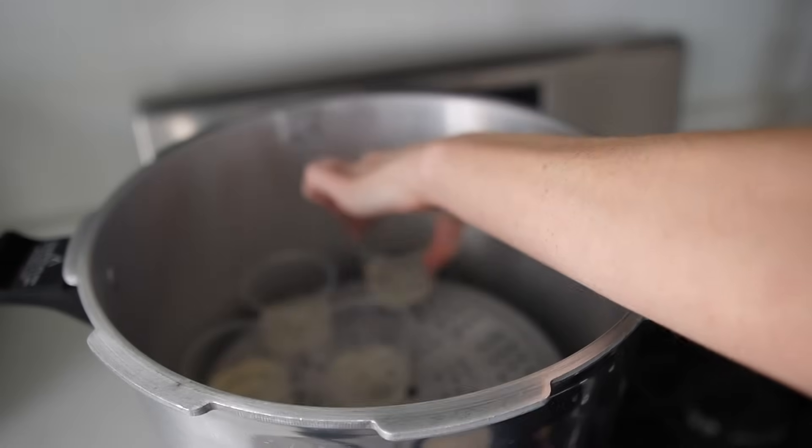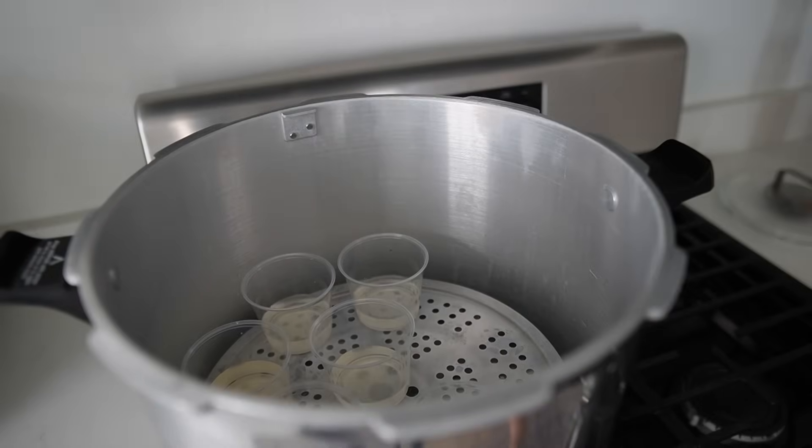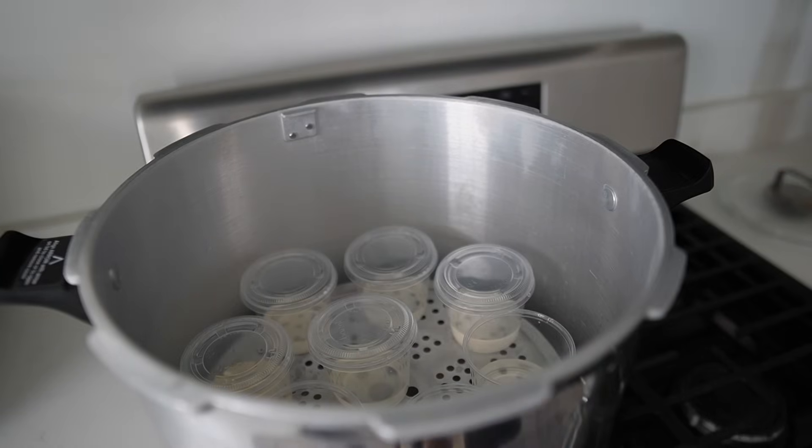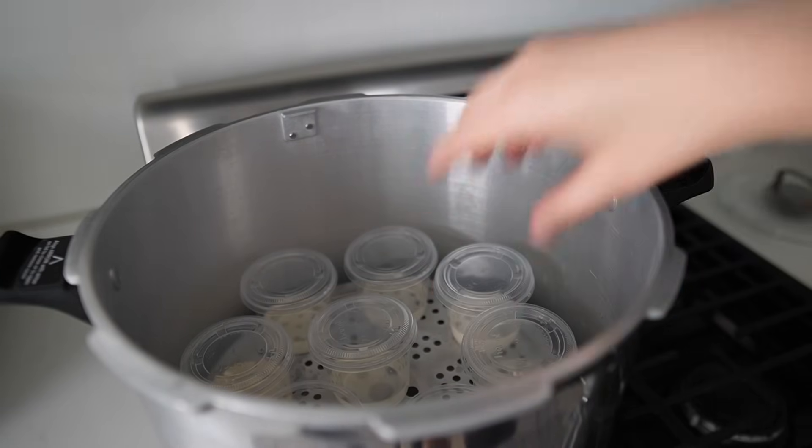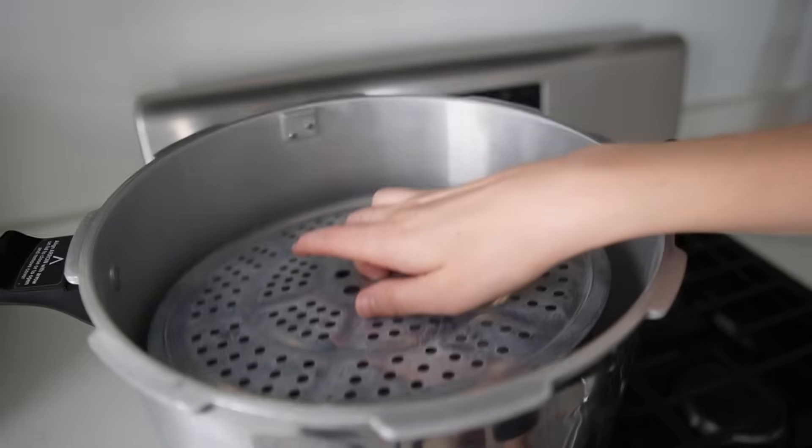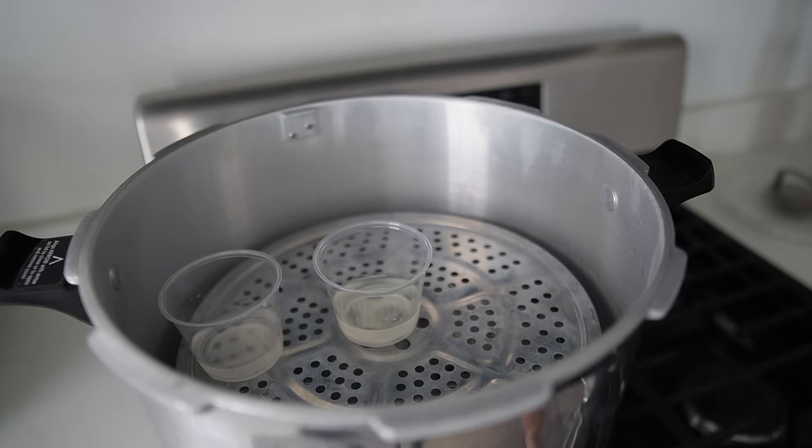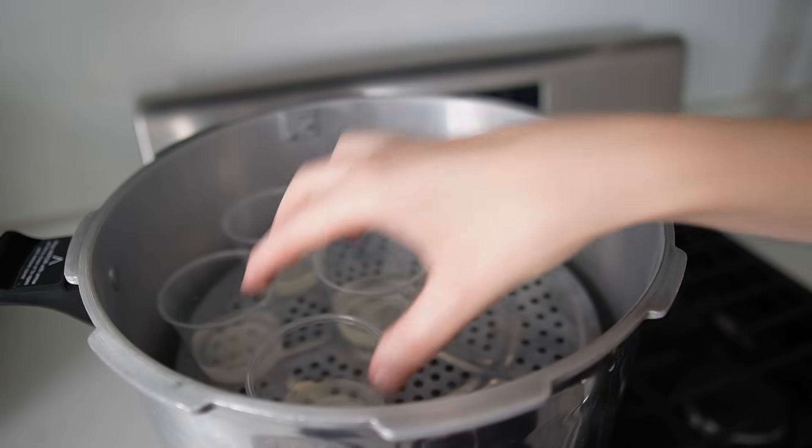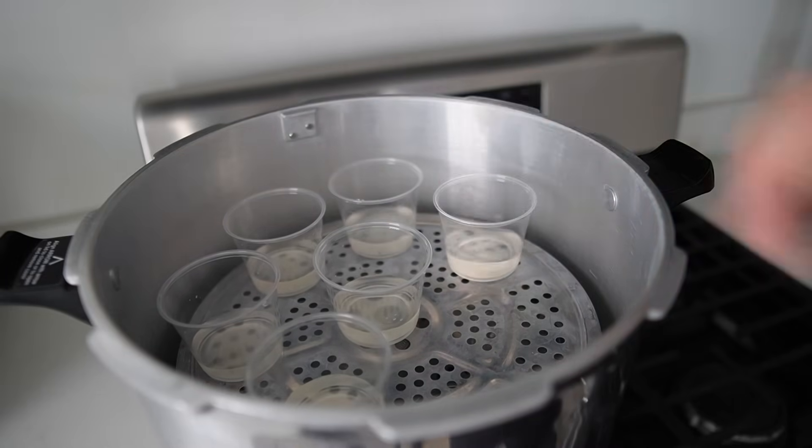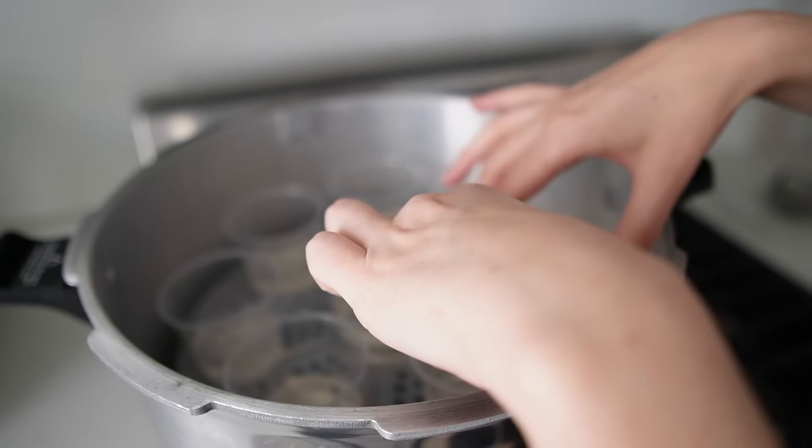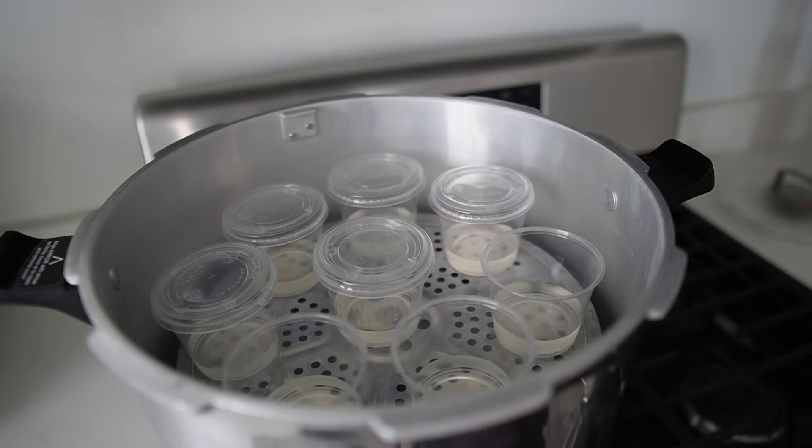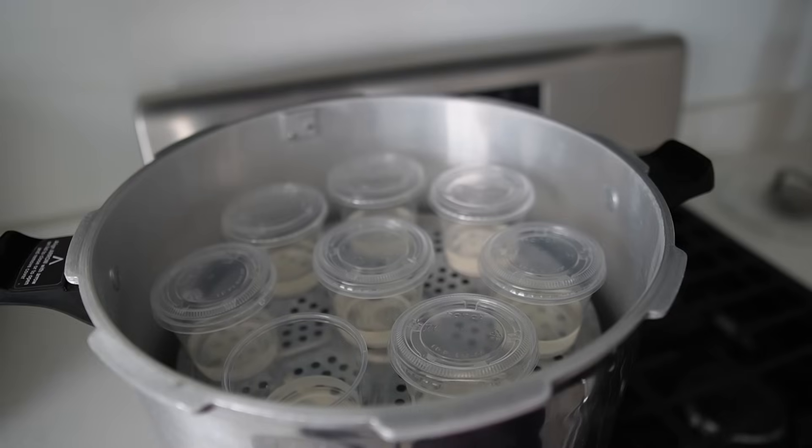These containers are going to get cooked at 15 psi for 15 minutes. When I use a pressure cooker to sterilize media, I use canning shelves to create multiple layers of containers inside of the pressure cooker so that I can sterilize the maximum amount possible, which, in case you're curious, is 24, if you're using the exact containers and pressure cooker that I have.